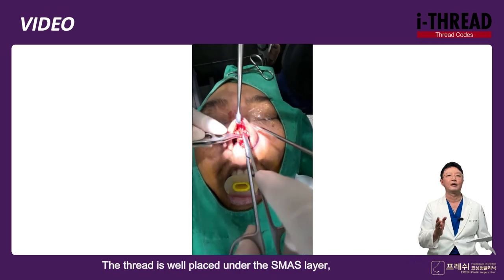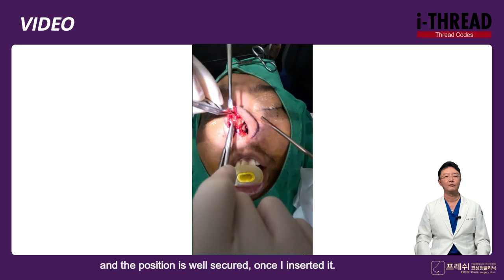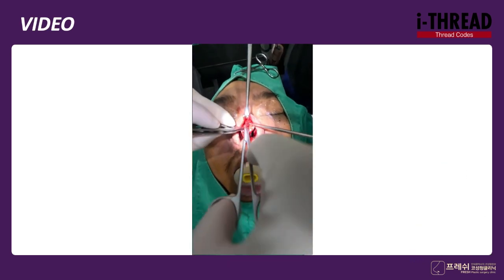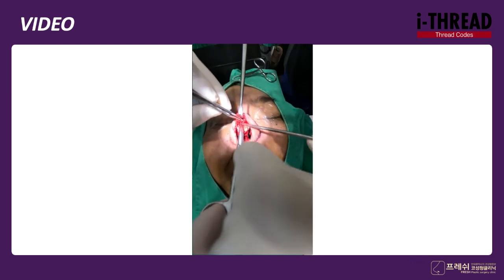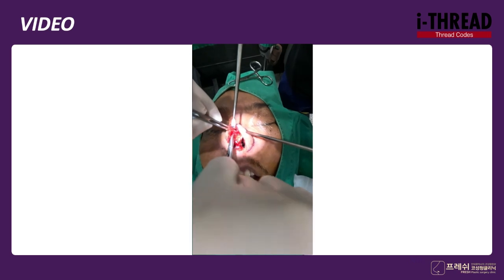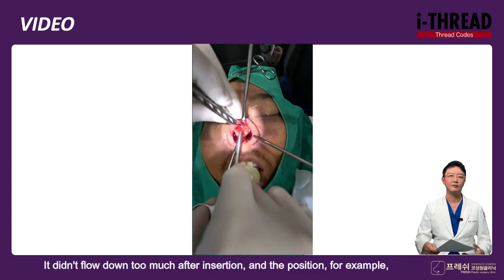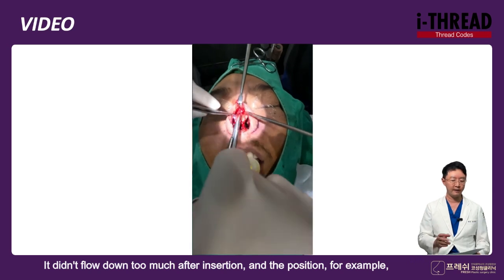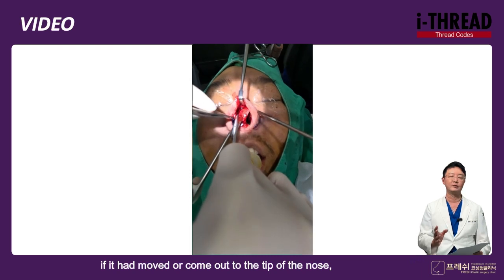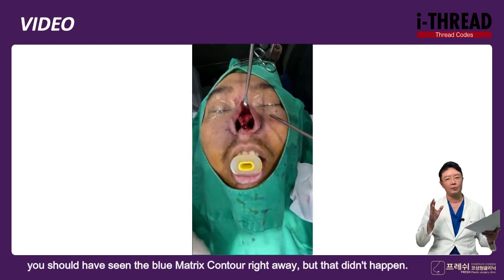The thread is well placed under the SMAS layer, and the position is well secured once I inserted it. It didn't flow down too much after insertion, and if it had moved or come out to the tip of the nose, you should have seen the blue matrix contour right away, but that didn't happen.